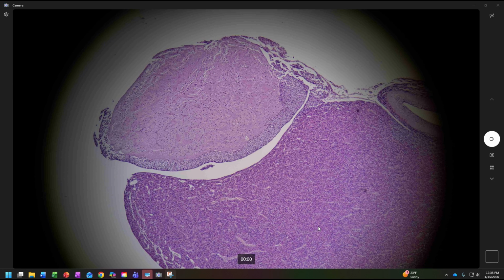The glands have a grainy appearance to them. And I'd like to think that I'm correct in saying that is a fairly transcendent property of all glandular tissue. It has this grainy appearance. We'll look into it as we zoom in. This is at 40x. As we zoom in, we'll see a little bit more of that.